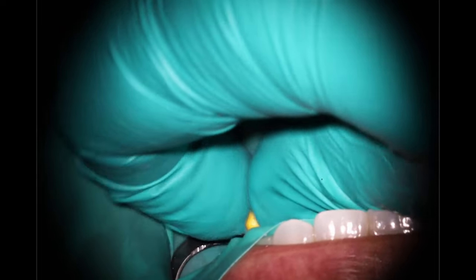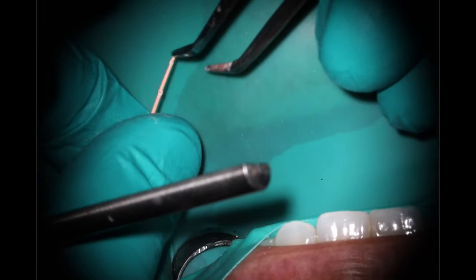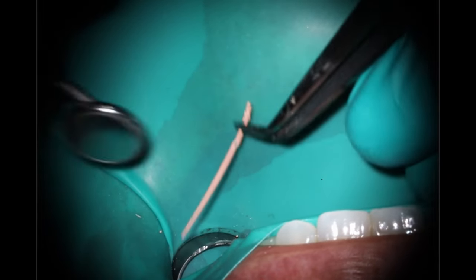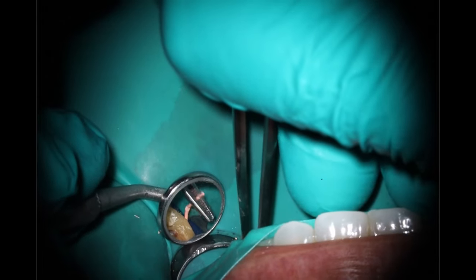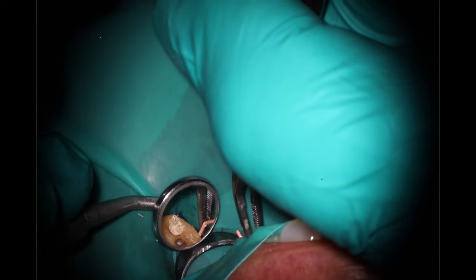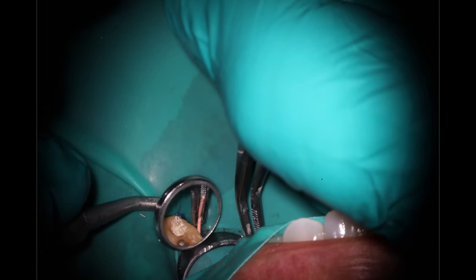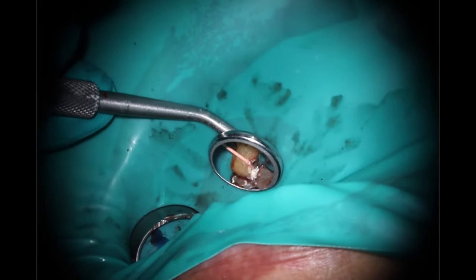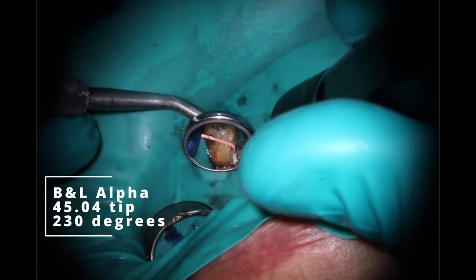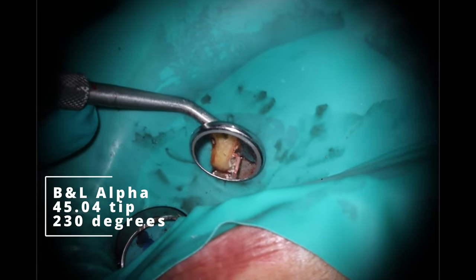Just like with the squirt technique, you can go back in with a 20K file that's been coated in sealer, recapitulate, make sure you are all the way down to your working length. That combination of the 20K file removing any impediments plus the sealer is going to do a nice job there. What you saw me do was I marked with the locking forceps where I was. And you can see as we go down, very awkward angle trying to get this in here — almost right there. And you can see I dropped down that final extra millimeter to make sure we are looking good.